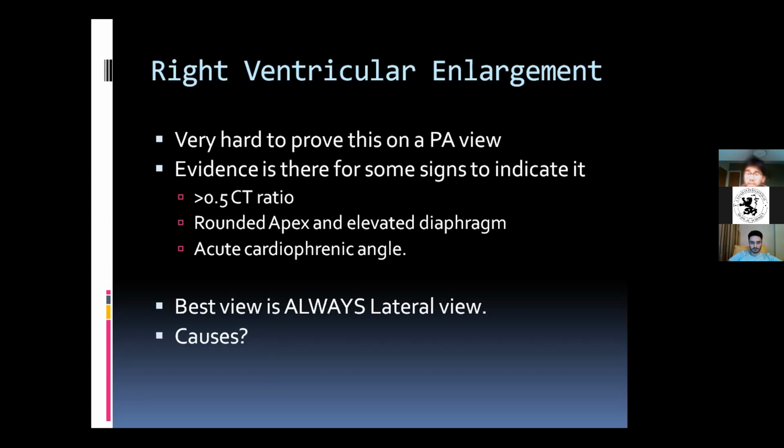So, by the way, the reason why I'm asking you causes, I know that you just want to look at X-rays and see the signs and things, but at the end of the day, you have to also relate whatever it is that you interpret back to symptoms. Perfect, exactly. Particularly if you are the doctor looking at the patient, you need to feed it back and you need to relay that to the radiologist. Exactly. That's basically what I was trying to say.